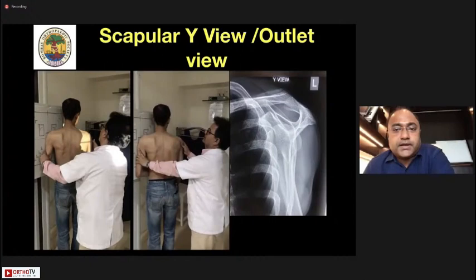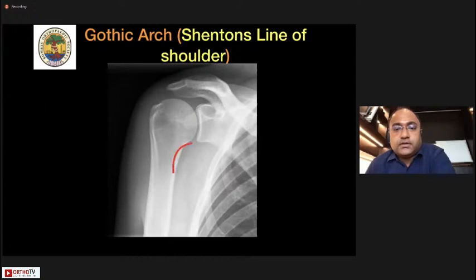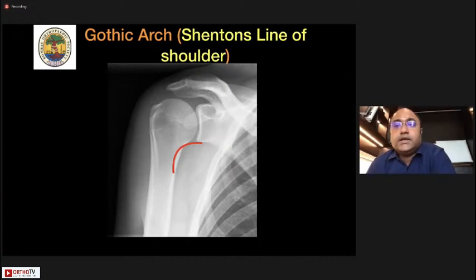You turn the patient such that the X-ray beam is parallel to the scapular spine in neutral rotation — that is the scapular Y view, giving you the morphology of the acromion, whether it is smooth, curved, or hooked. The true AP view gives you the gothic arch, telling you there is no overriding of the humeral head. Acromiohumeral distance less than six or seven millimeters makes us worry whether the cuff tear is irreparable.